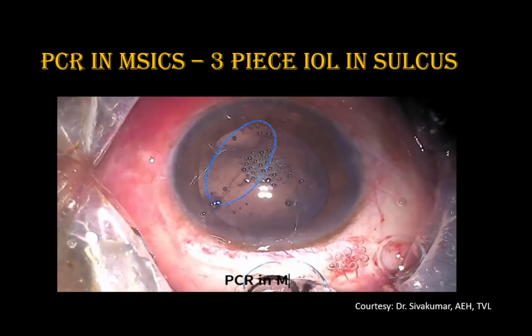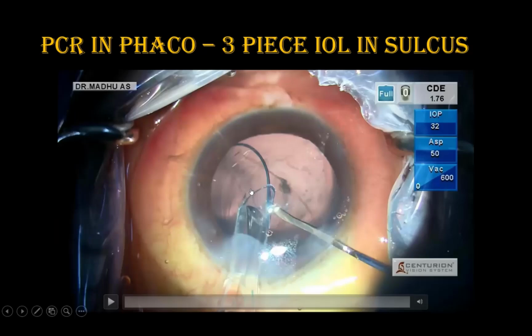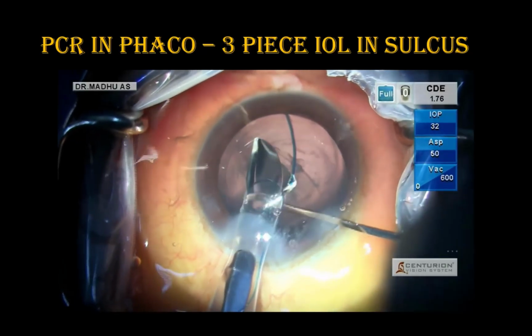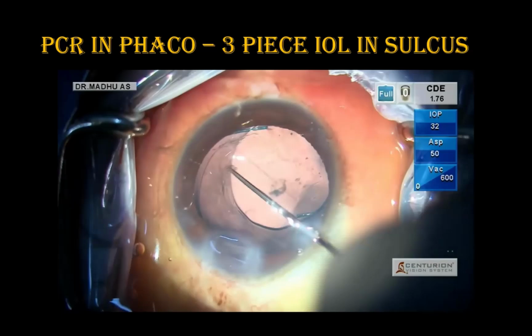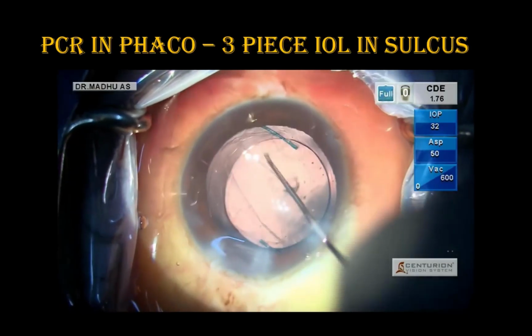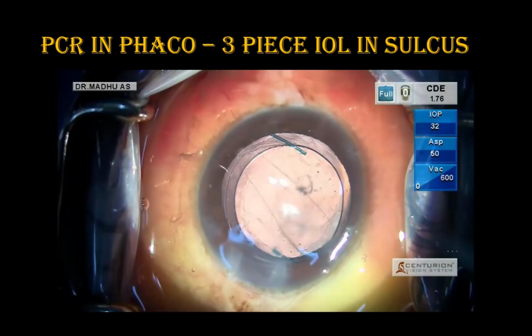Coming to placing a three-piece IOL in phaco cases with PCR, you should avoid going through the wound assisted. Always make your wound slightly larger so that you can place your injector in the center of your pupillary margin, and then you start injecting. Always make sure how the haptic is opening, since sometimes the loading will be slightly different. Always support your IOL with a spatula below the optic, because this type of three-piece IOL has a tendency to tilt or go into the vitreous cavity. So always support with the spatula, go up to the mid of your pupillary margin and then start injecting, see how the haptic is opening, and accordingly you can twist your hand and it will go in the correct orientation.